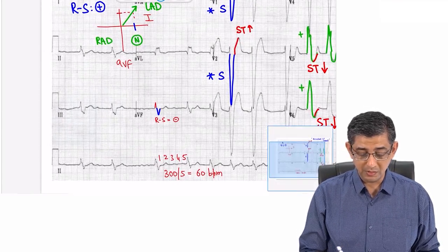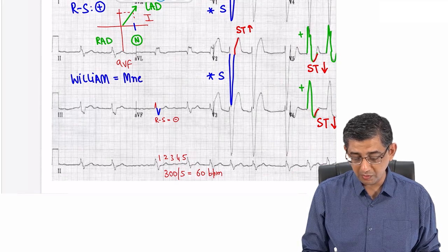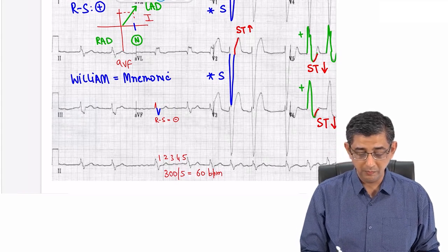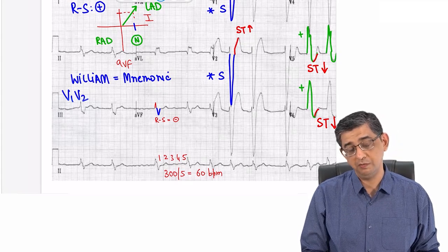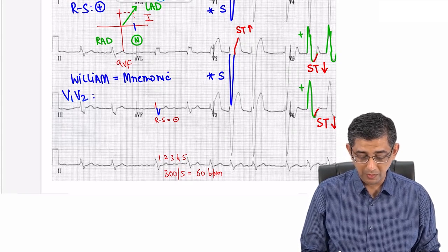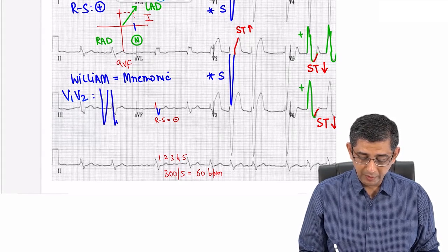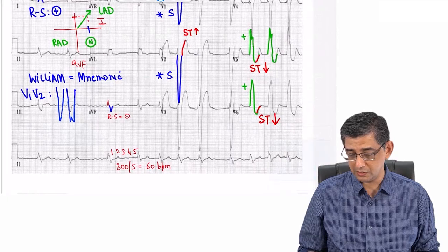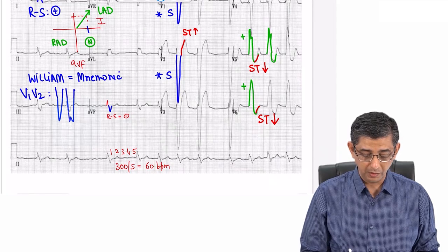Now, because a lot of students say, sir, we find it difficult to remember all this, so I'm trying to give you a hack here. That's a mnemonic that you can use to remember findings of left bundle branch block. That is called William. In William, you need to remember the W alphabet is the first alphabet here. So for V1 and V2, you just need to remember that there would be a deep and a broad S wave. If it's going to be kind on you, there will definitely be a rabbit ear appearance given. Like in this particular case, a bit of rabbit ear appearance is well noticed in lead number V5, V6.